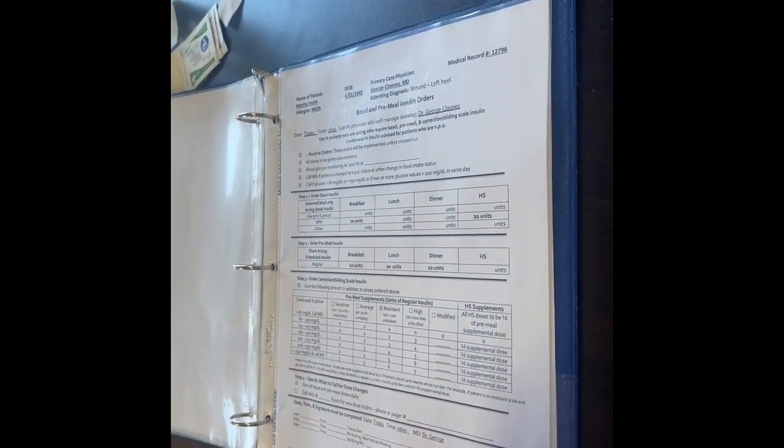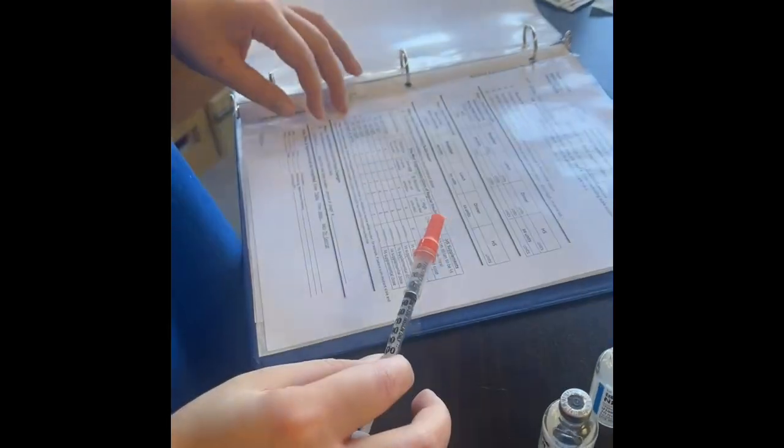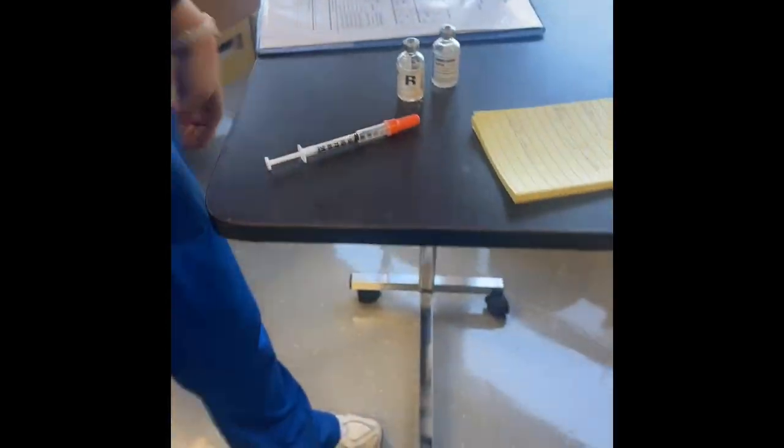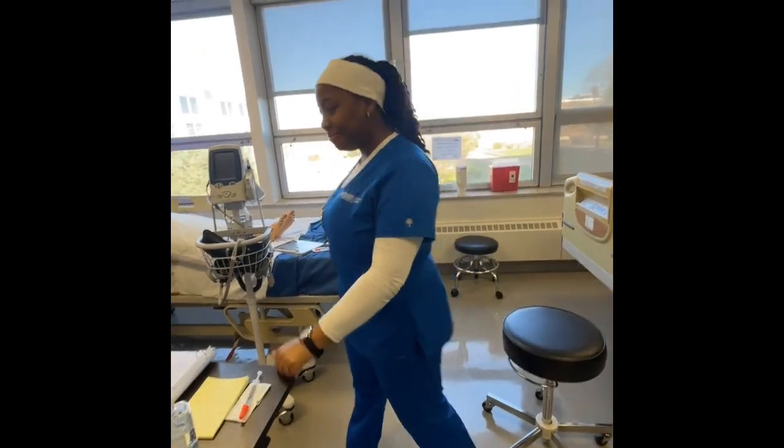Alright, so I'd be comparing my label to here, so 20 we have, and then plus the 14, perfect, and once more, perfect, we have the right amount of insulin. Now let's go give it to Martha. Now we'll be administering the insulin.